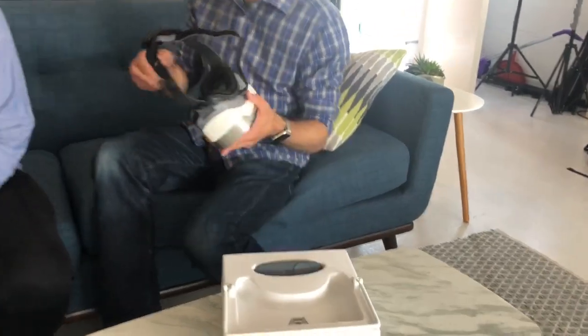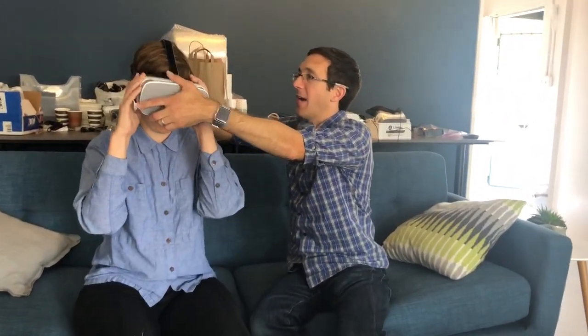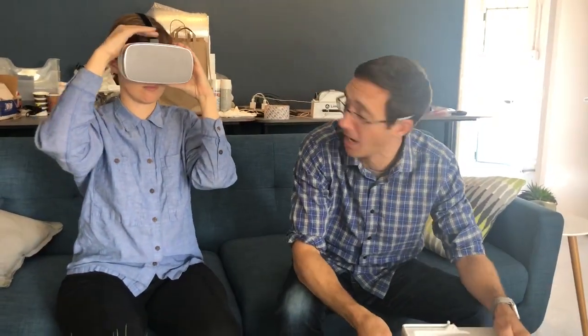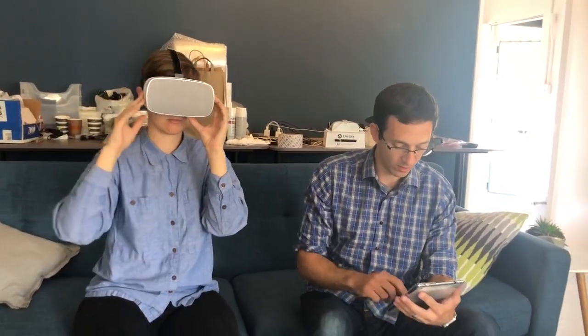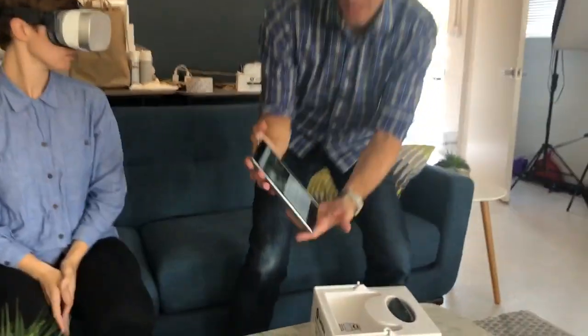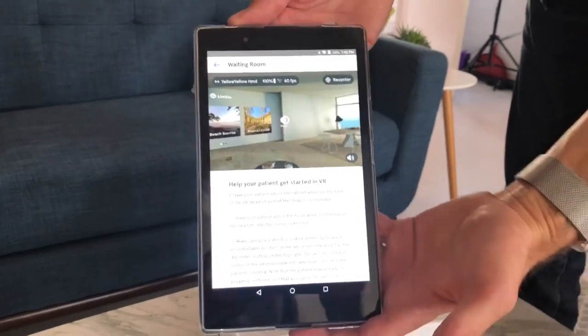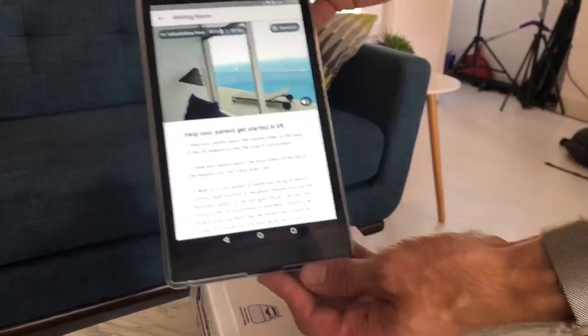So I'm going to put my patient in virtual reality by doing this and then tightening the ratchet in the back and having her adjust the focus wheel at the top until she can read the middle of the screen clearly. And what we have here is the tablet interface. So this lets us see what our patient sees and control her virtual world.